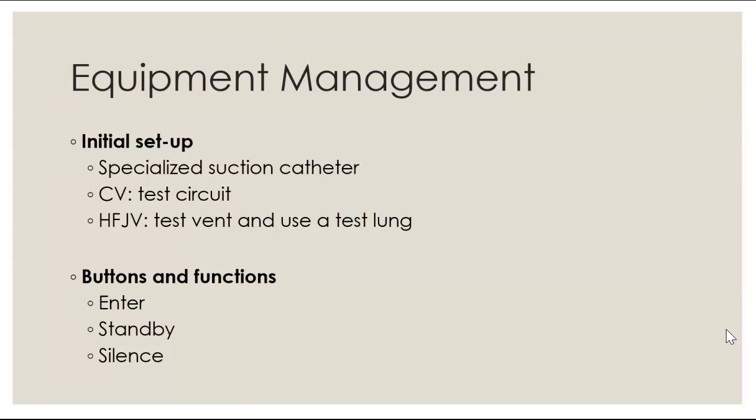Okay, equipment management. So, initial setup, remember you have that specialized suction catheter, and then perform the device check and the breathing circuit check on your conventional ventilator so that you're giving accurate flows and pressures. And then, same with the high-frequency jet ventilator. After you get some settings in, you'll use a little test lung, which is very, very technical: we just cut a finger off of a glove and put it over our LifePort adapter to assess the function of our ventilator. And then there's also a test button that you'll press just to test the function and the screen of the ventilator.